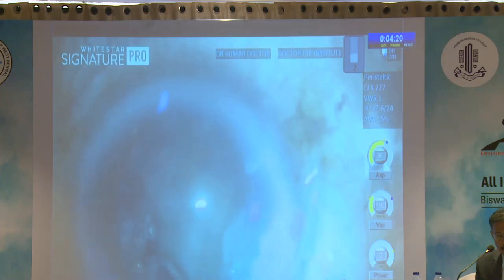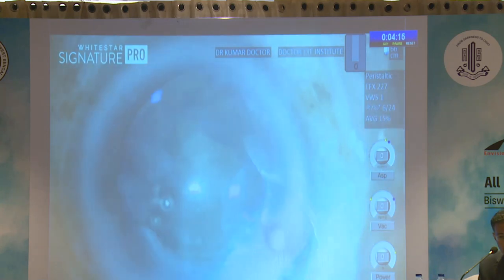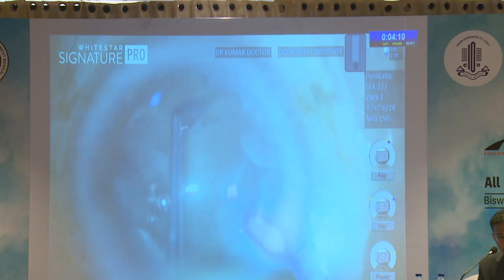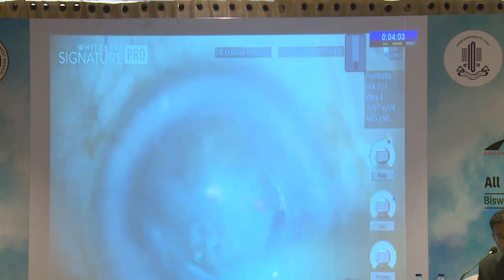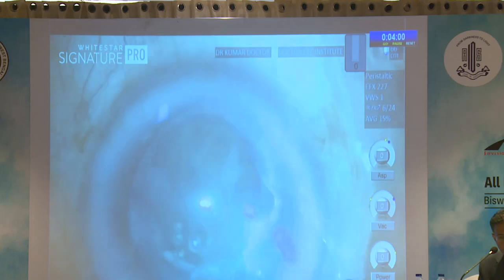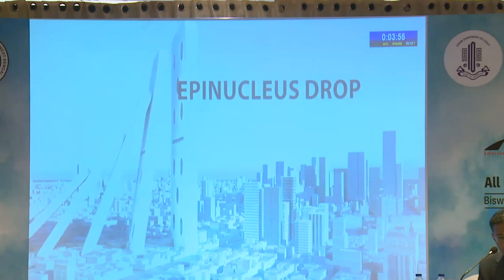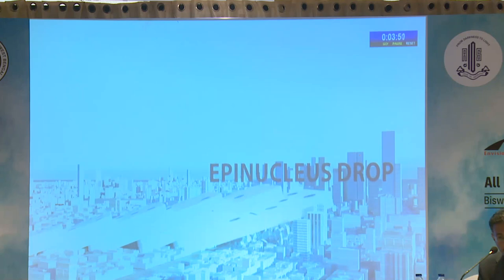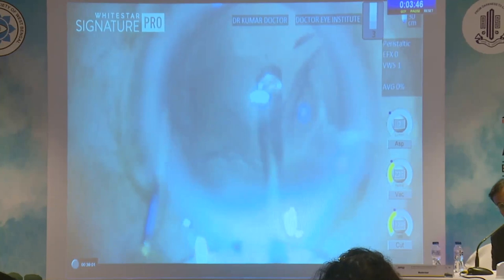Now we think of multiple possibilities at this point as to what can be done. The best would be to try to get the nucleus into the anterior chamber and to phaco it. So finally we are increasing the size of the rexis so as to get the nucleus out. Anterior vitrectomy is performed.